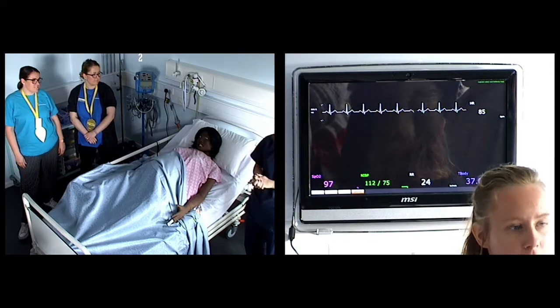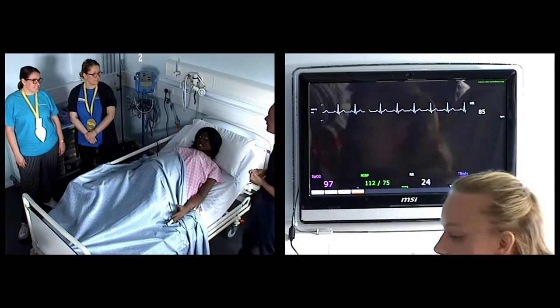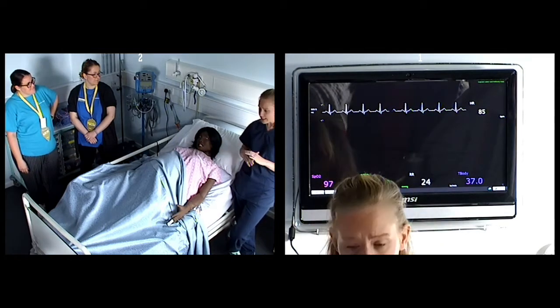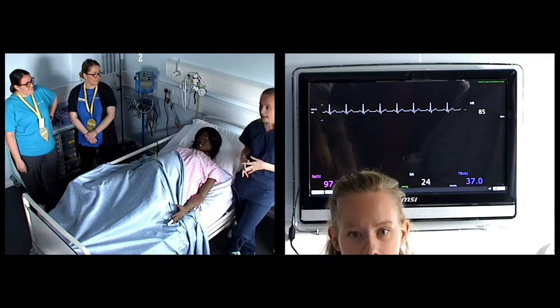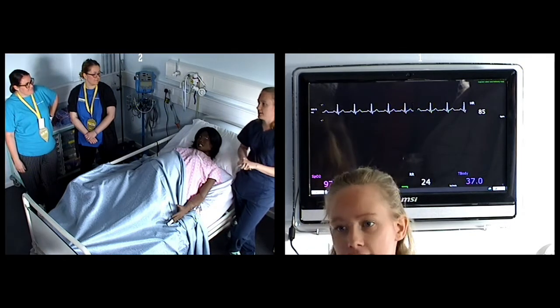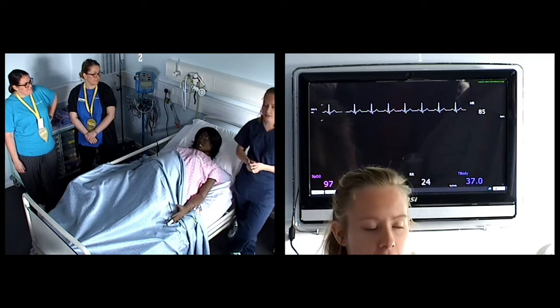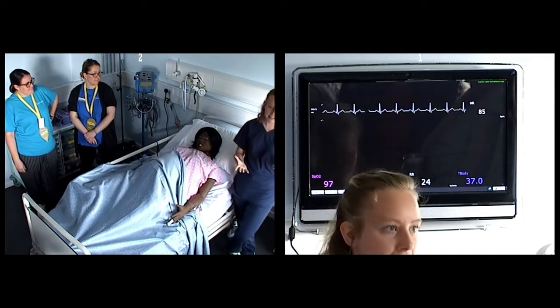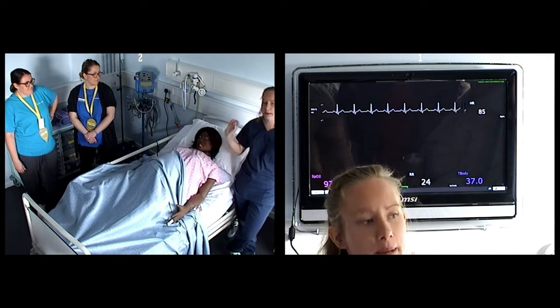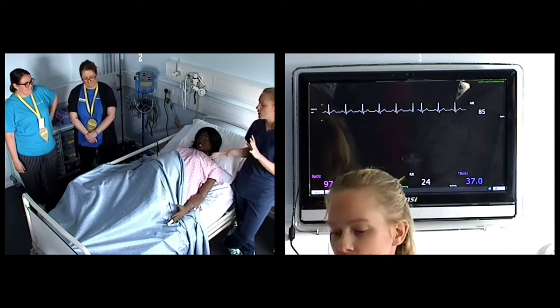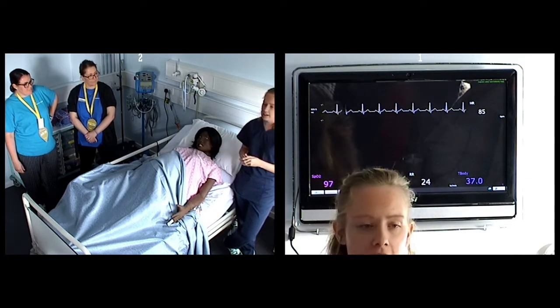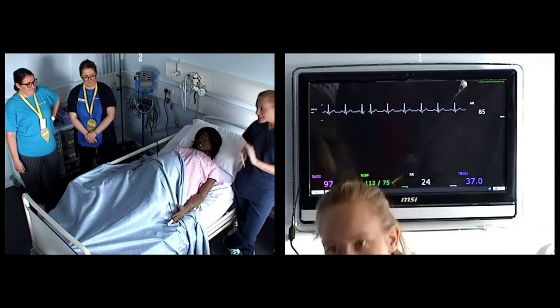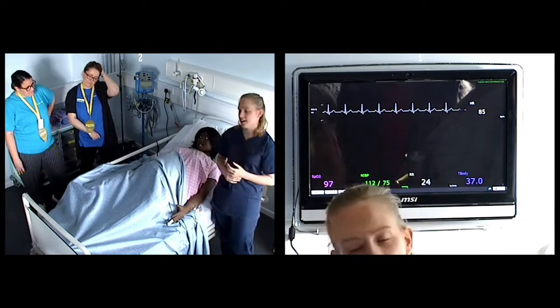We also have a uterus that we can make boggy, and you have to do proper massage in order to rectify a uterus scenario. She is quite versatile, but today we're just going to do a standard birth with no complications. However, we can replicate things like the shoulder getting stuck. She's a very useful training tool because out in practice you see lots of different things, but we can't guarantee all students are going to see the same thing, so this enables us to give all students a baseline experience.